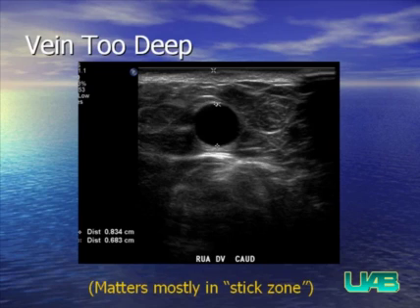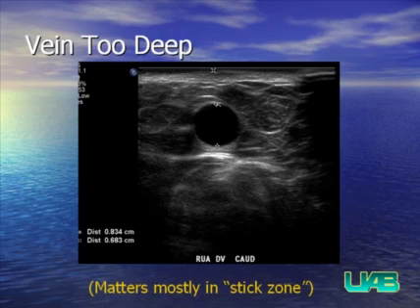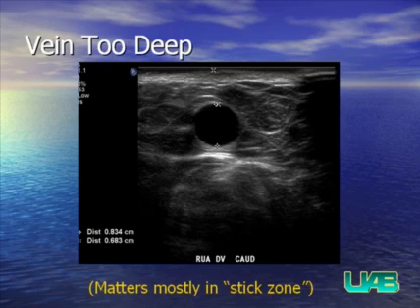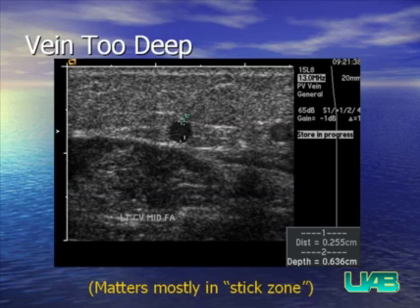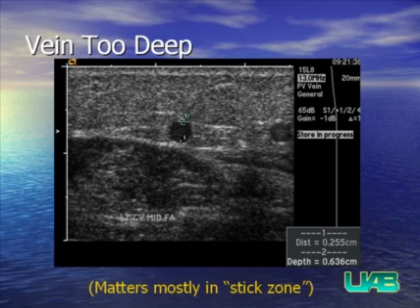The third abnormality is a draining vein that is too deep for consistent vascular access. Although the diameter of the vein may be 8 millimeters — well above the 4-millimeter threshold — if it is greater than the 5-millimeter depth threshold, it is not easily accessible. Another example in the cephalic vein of the forearm shows a small draining vein over 6 millimeters deep, which most nurses would have difficulty accessing.